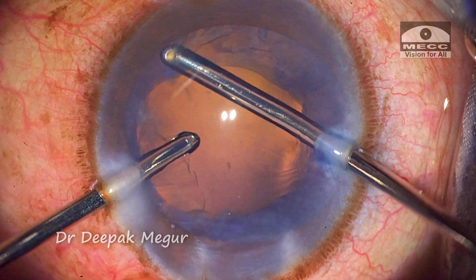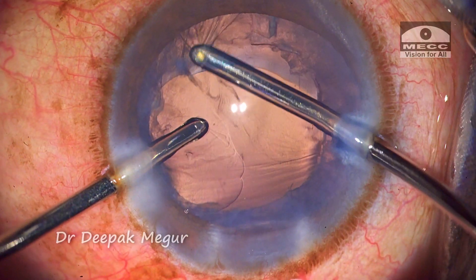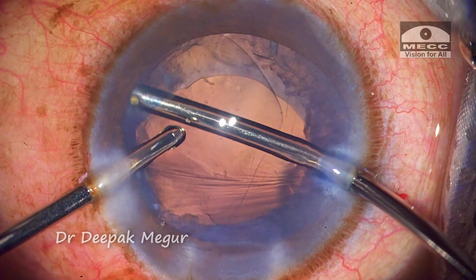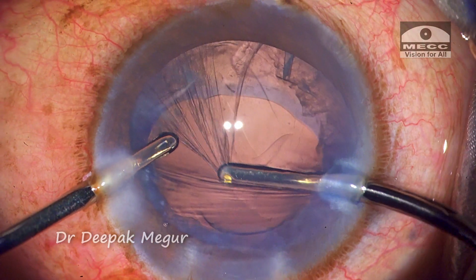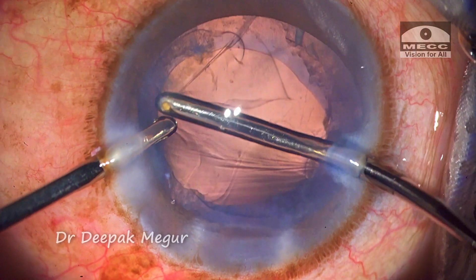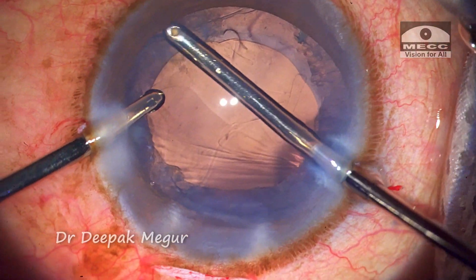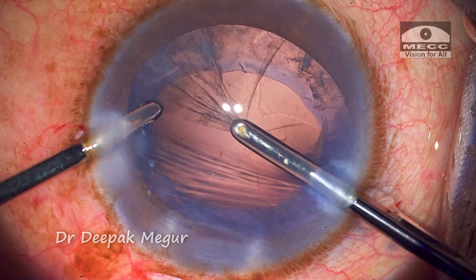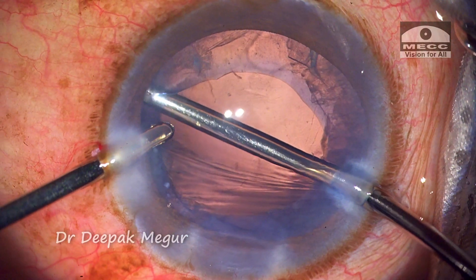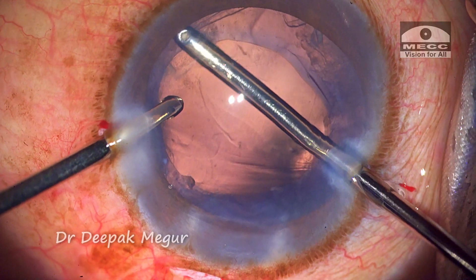Aspirating the cortex is quite challenging here for two reasons: there is progressive forward bulging of the posterior capsule, and the anterior capsule and posterior capsule are literally touching each other, leaving no space to aspirate the cortex. Secondly, removing cortex entrapped under the CTR is tricky in eyes with loose zonules. I increase the infusion pressure slightly to push back the posterior capsule.